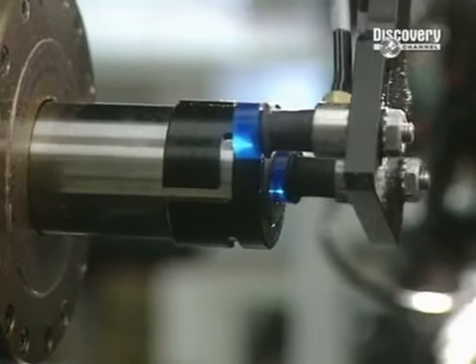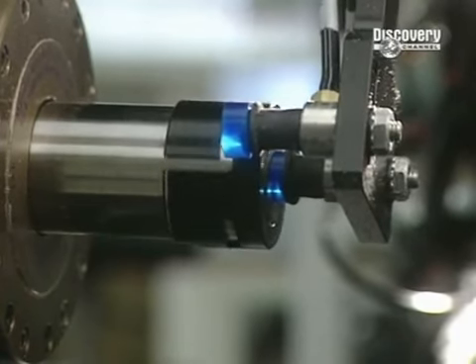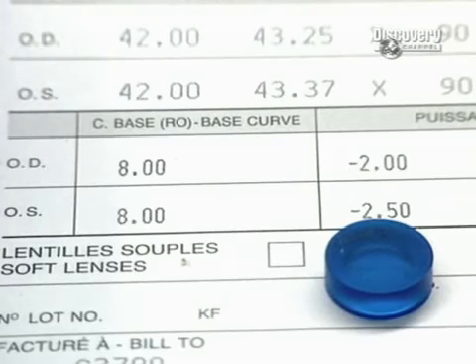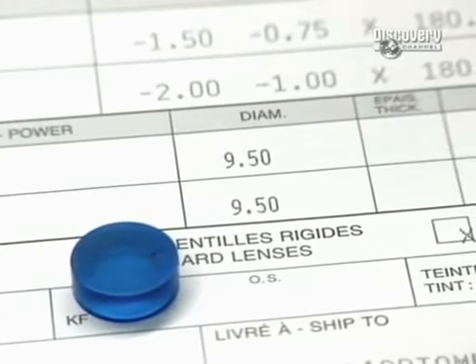These small discs are used to make soft polymer contact lenses in a variety of colours. Of course the place to start is with a patient's prescription, which has been digitised for the process to begin.